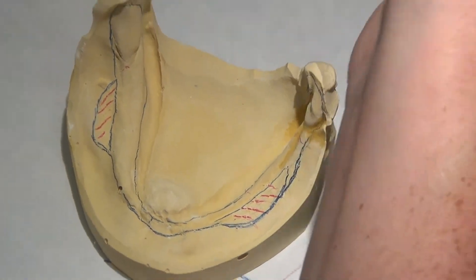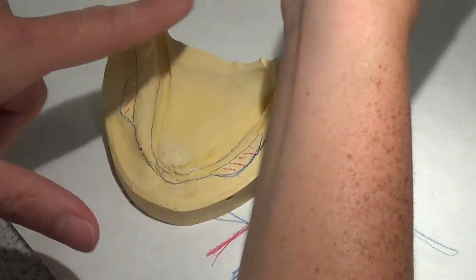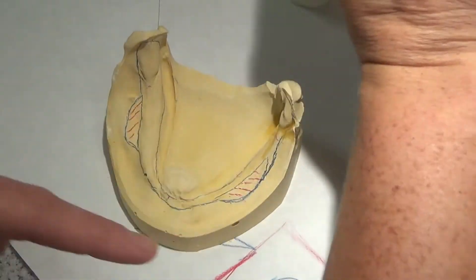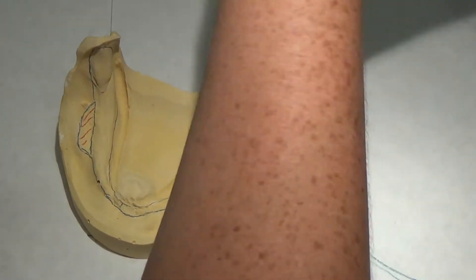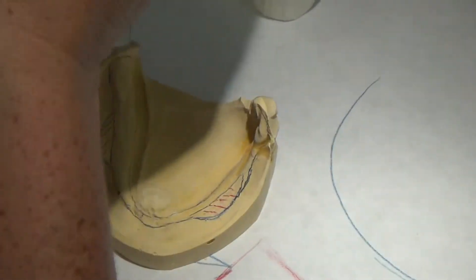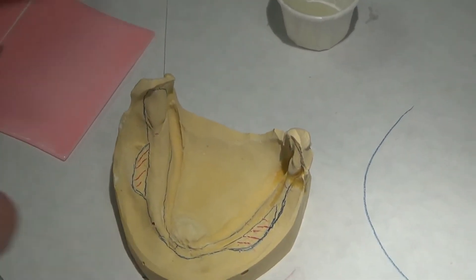So I'm going to start by heating this up. Because her jaw or her arch form is wide in the back, she's kind of U-shaped, V-shaped combo here. I want to make sure that I get enough wax. And I'm probably just going to do this in two sections.